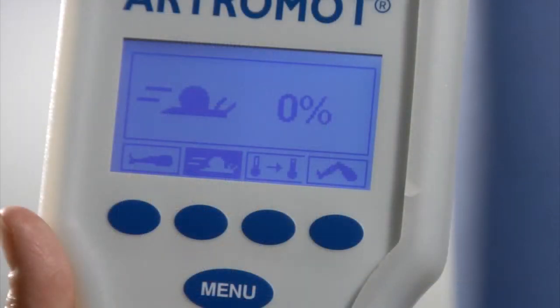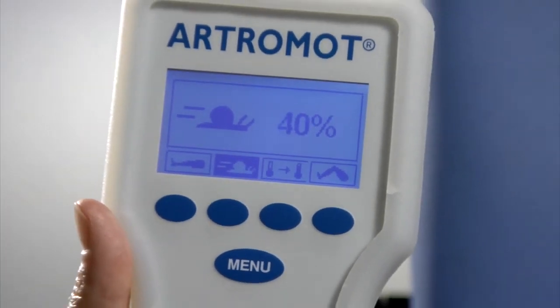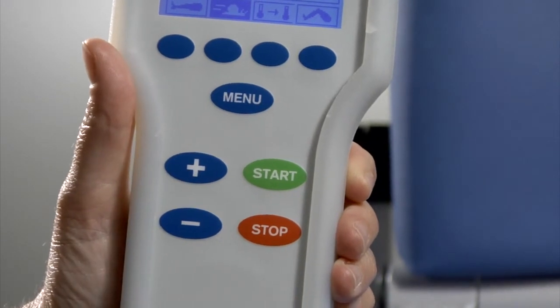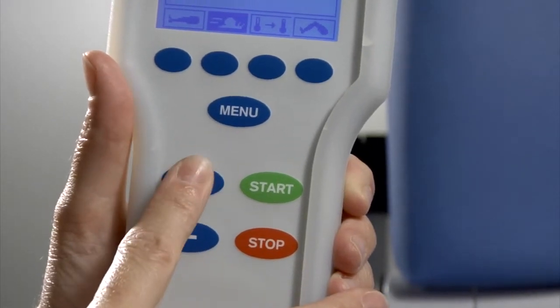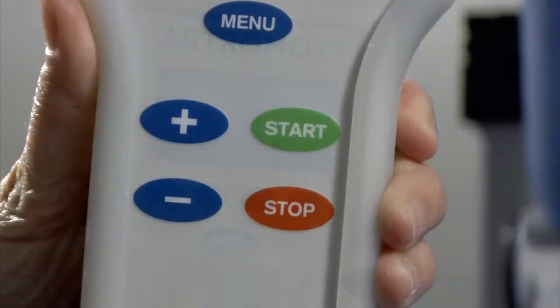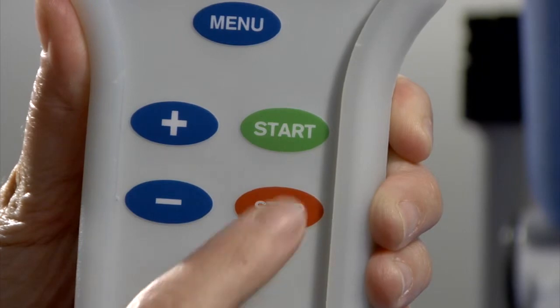To the right of the extension symbol on the display is a picture of a snail. The snail picture represents the speed at which the machine will run. To adjust the speed, press the blue button beneath the speed setting and change using the appropriate arrow. The machine should be set at a comfortable speed for the patient, keeping in mind that the more passive repetitions that the patient is able to go through, the better. The stop and start buttons are clearly marked on the hand control and perform their stated functions.